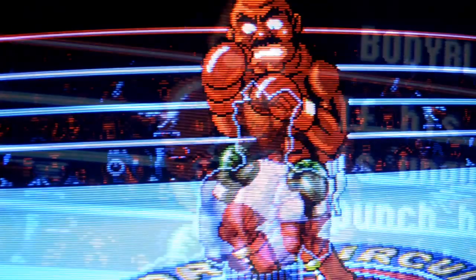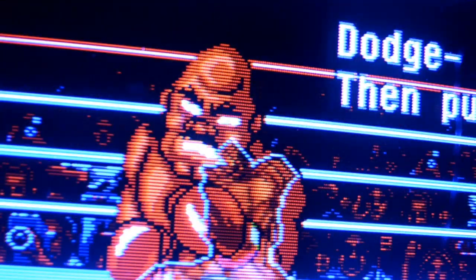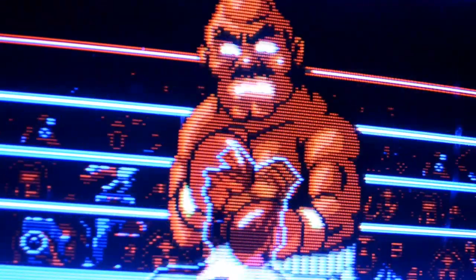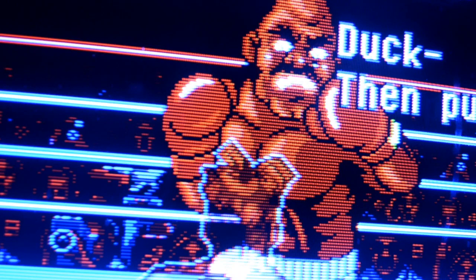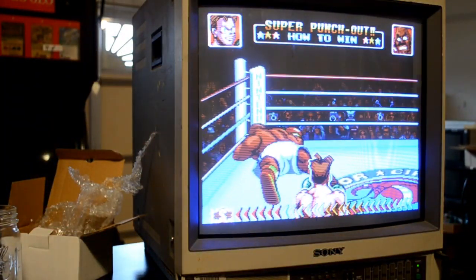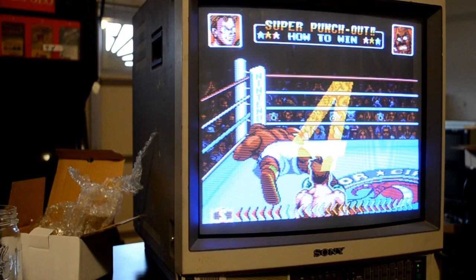There also was a bit of a screen blur where it was out of focus just slightly. And I feel like there were some capacitors that were probably failing and not giving us the best look on the sides for like pin cushion, because those should be a little bit more uniform than what they look like right now on the screen. But anyway, this is just a quick look of what this thing looked like before.